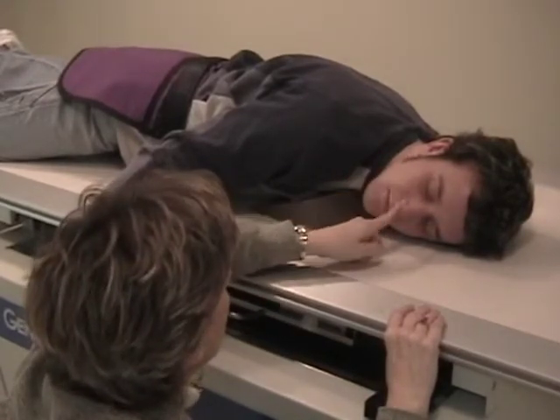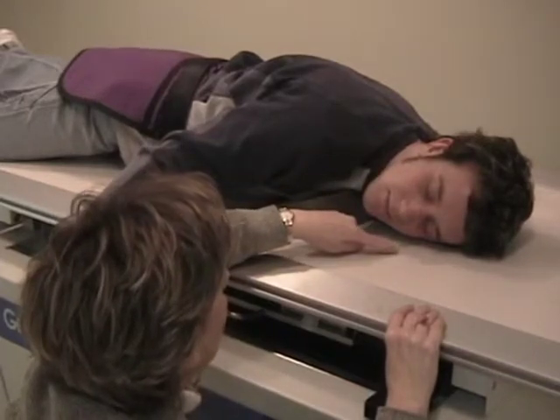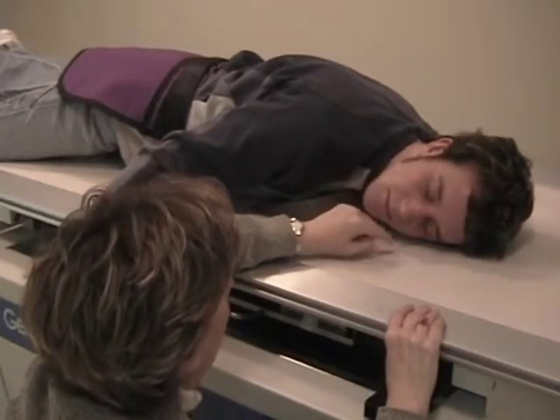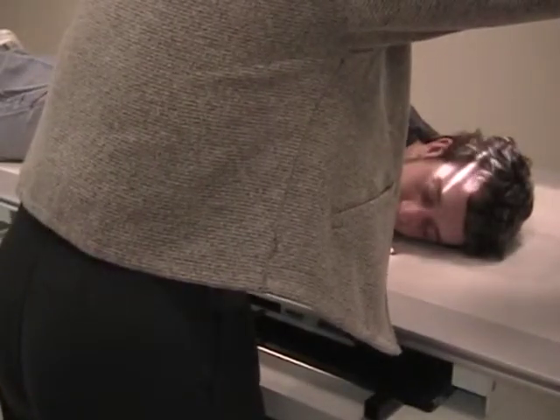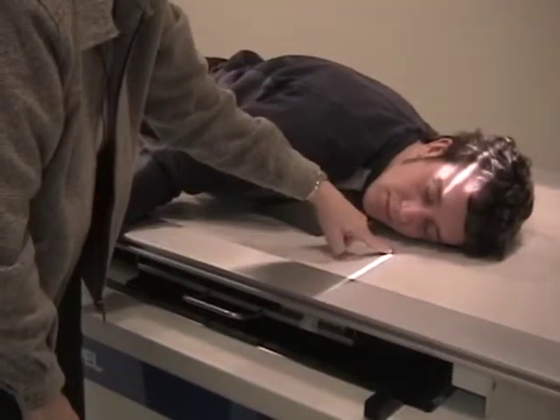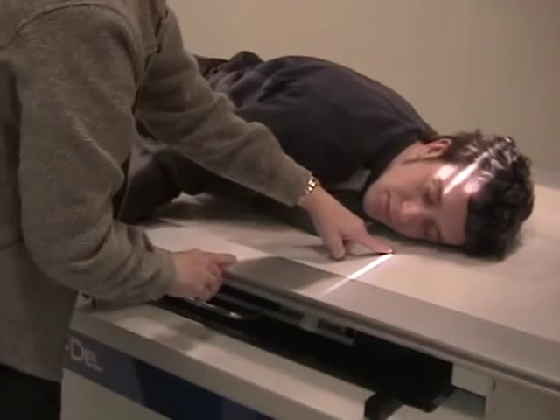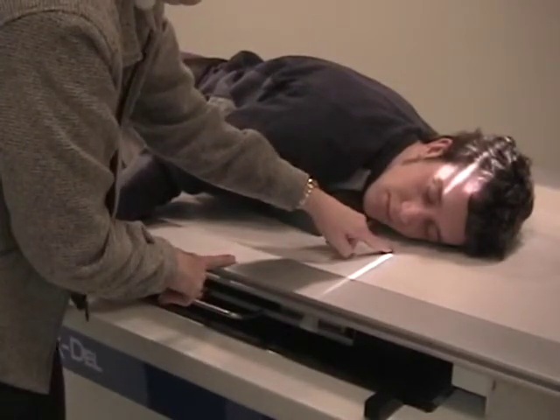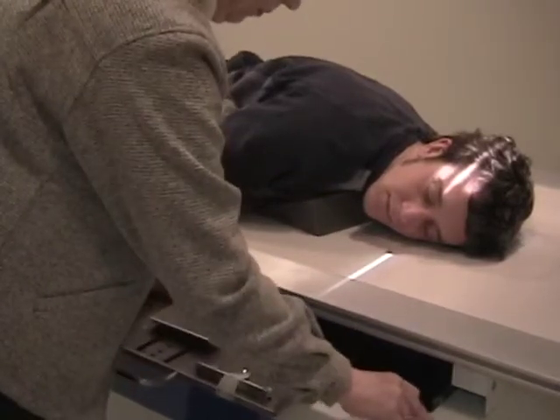But I know where the TMJ is because I'm using this as a reference point, and I can tell it's right there on the table. Okay? It's right there. And I want the central ray to exit right through that TMJ. It enters superior to the one above it, and it exits to the one of interest right down there. And then, of course, it would exit to the center of the film.